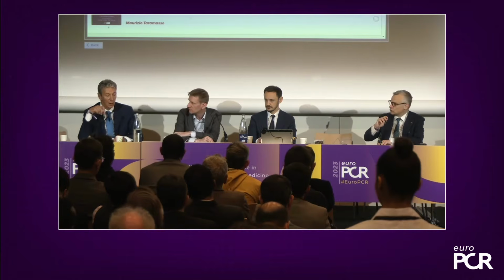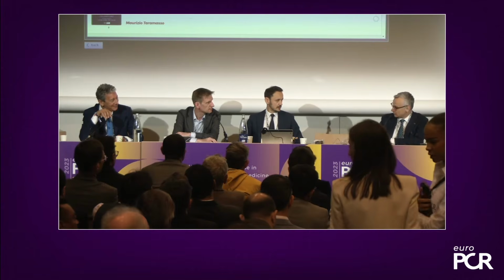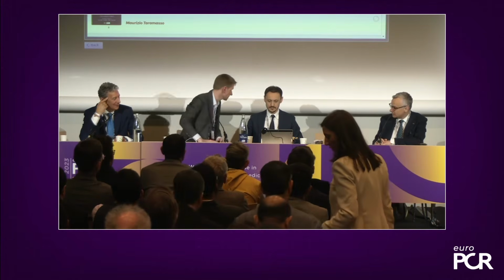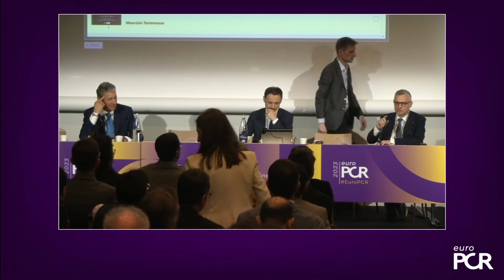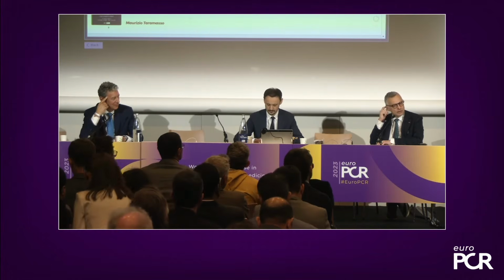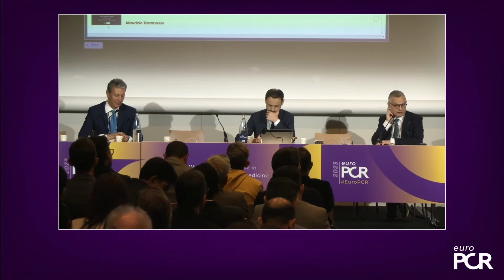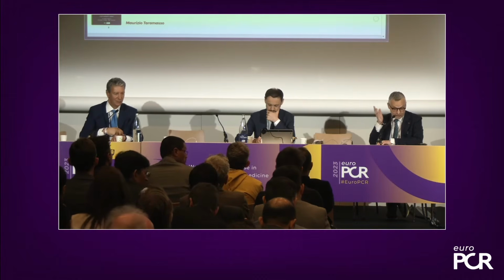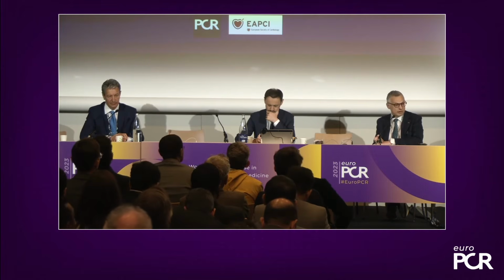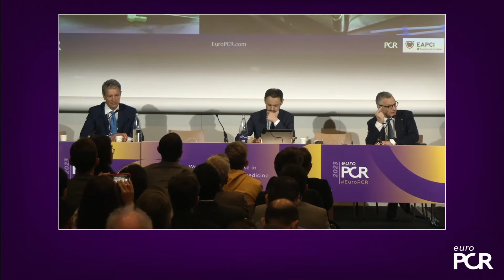That's an important point. Sorry, but talking about 45 degrees, this rule comes up often. Why don't you show us the simulator to understand the importance of 45 degrees? Because this is another potential pitfall once you deploy, and I've seen it often done using ProStyle, now the new version. If you don't keep it at 45 degrees, you are spoiling the whole procedure just for this little thing.